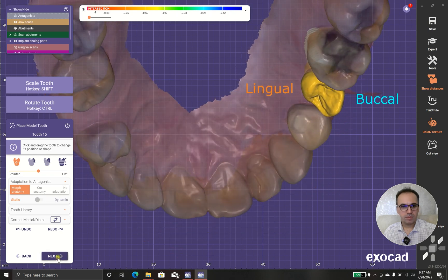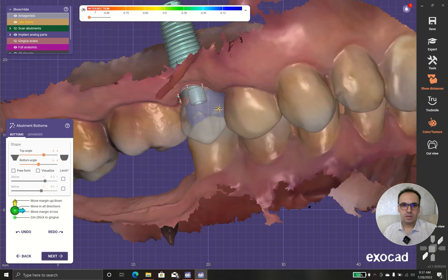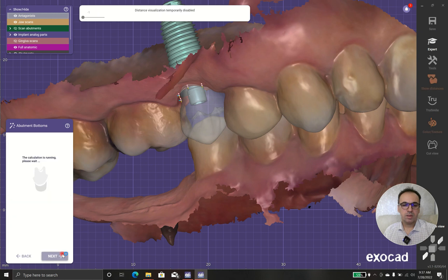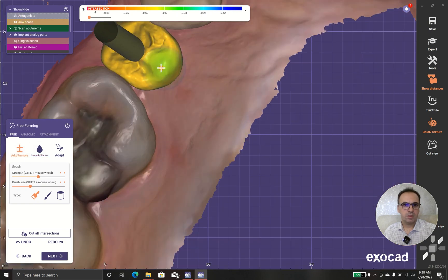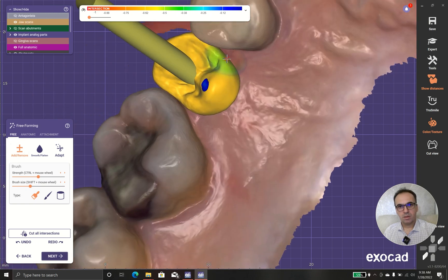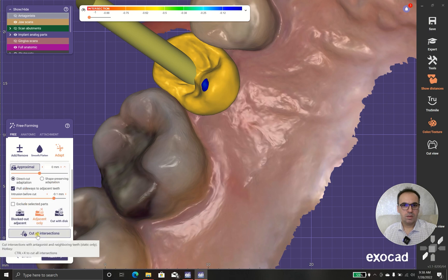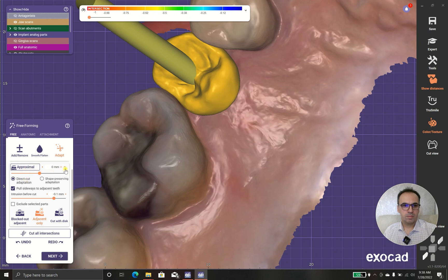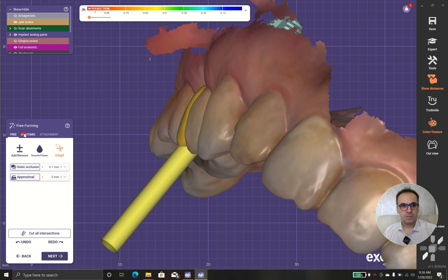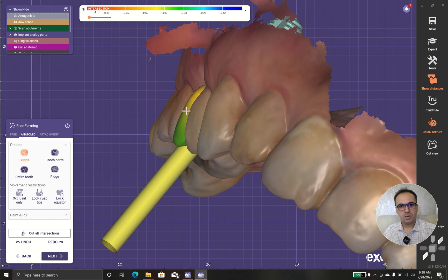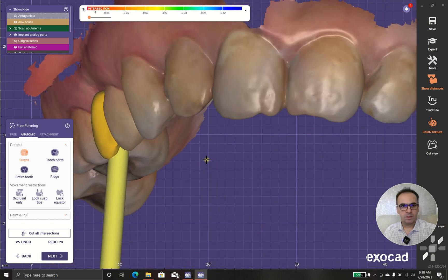I try my best to put the teeth in proper position, but sometimes it's not easy to get that. You can change the teeth to match the neighboring teeth properly. I think it looks good.